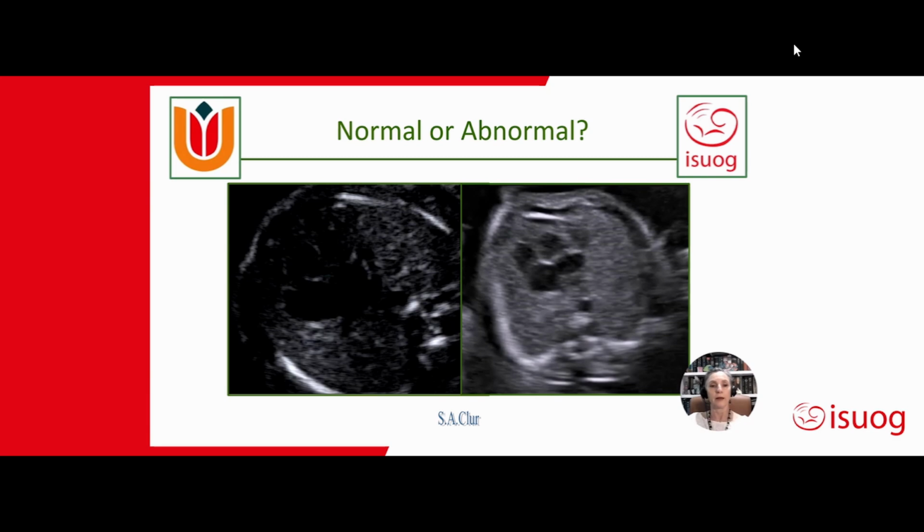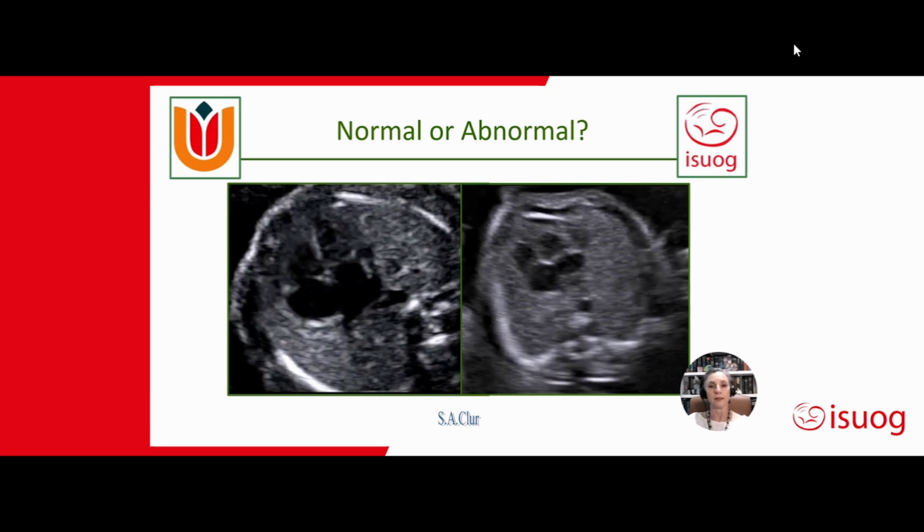So here we have a quiz for you. Is this normal or abnormal?